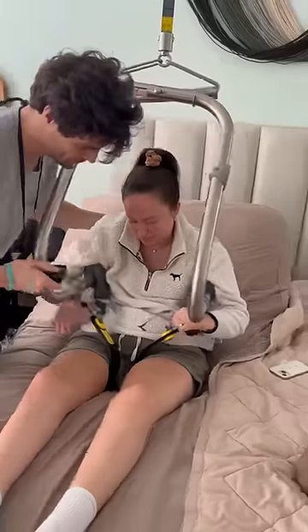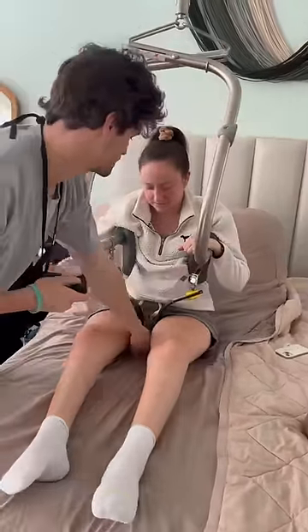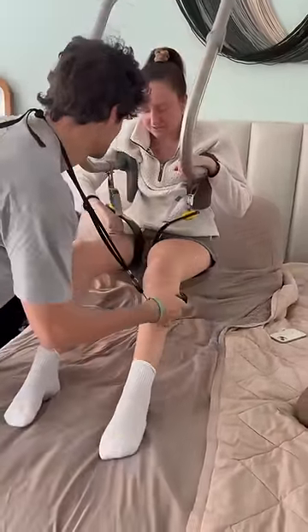Then Jack helps me sit up and I make sure I'm positioned well in the middle, and then it squeezes my ribcage and lifts me up.